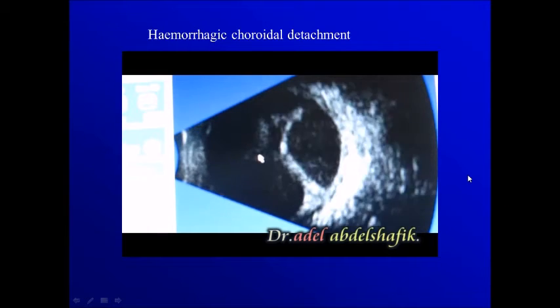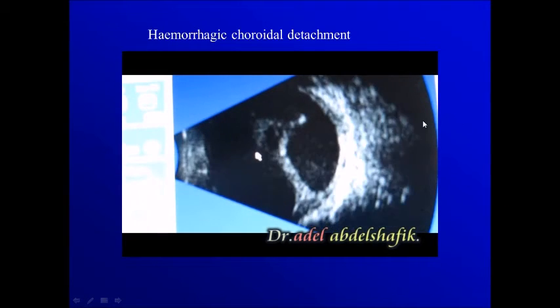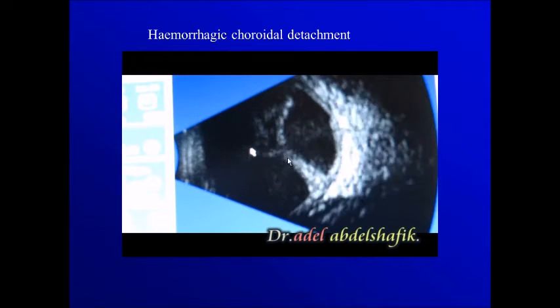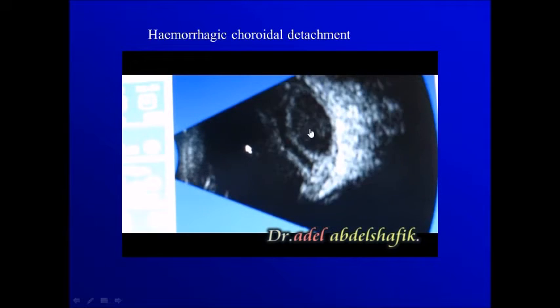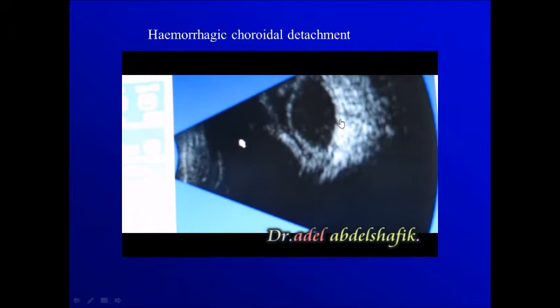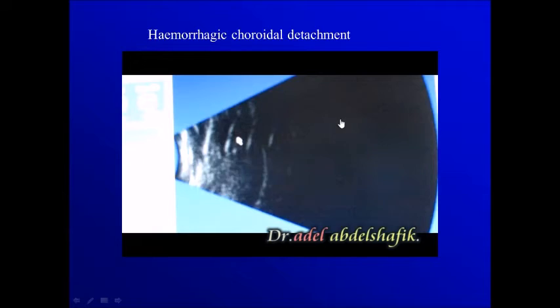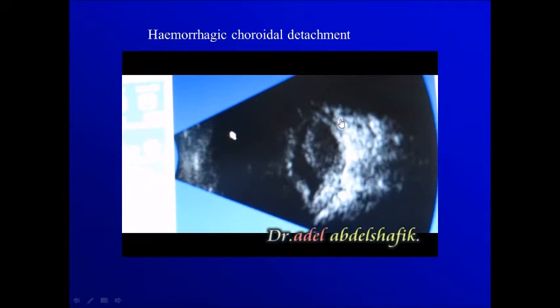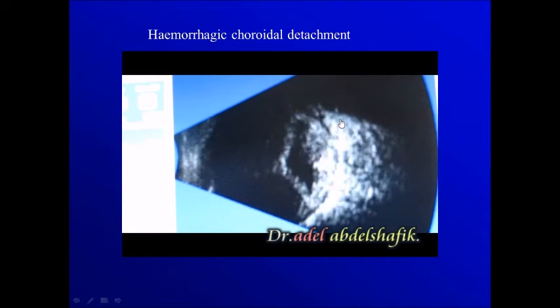In this example, we have a choroidal detachment, but you notice under the detached choroid we can see reflections. This is a hemorrhagic choroidal detachment.